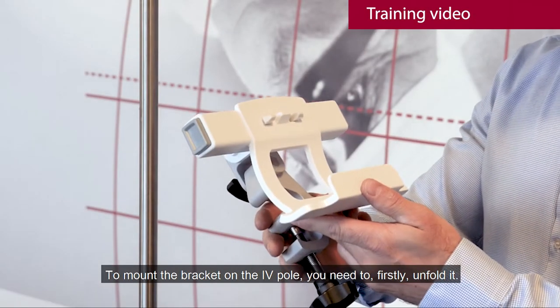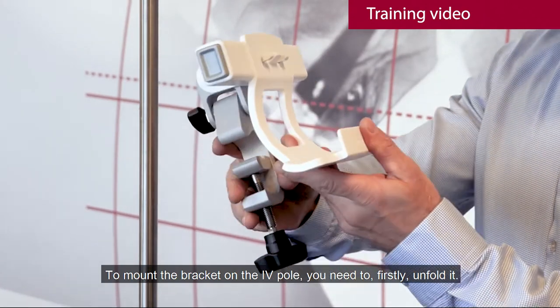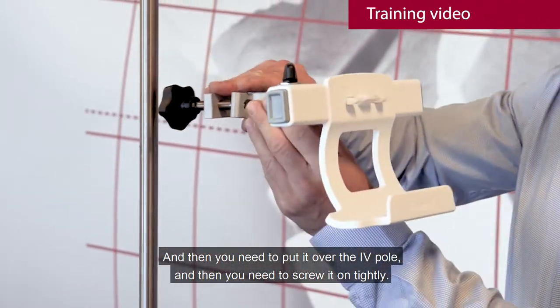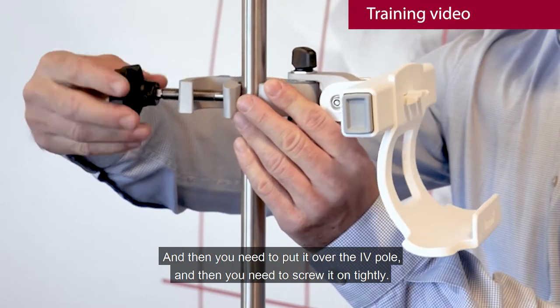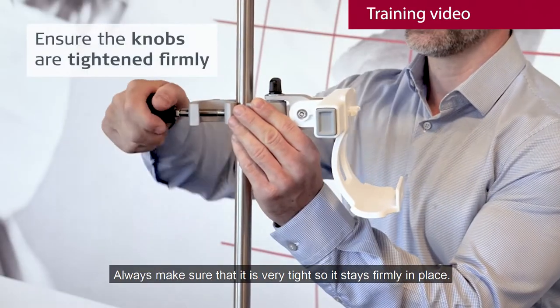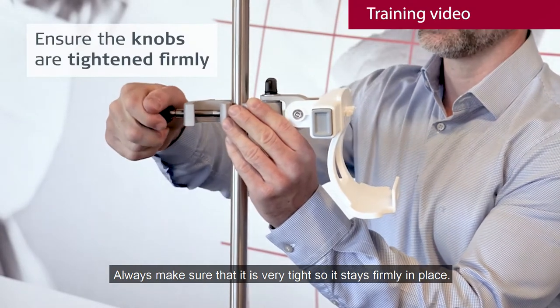To mount the bracket on the IV pole, you need to first unfold it, then put it over the IV pole and screw it tightly. Always make sure that it's very tight so that it stays firmly here.